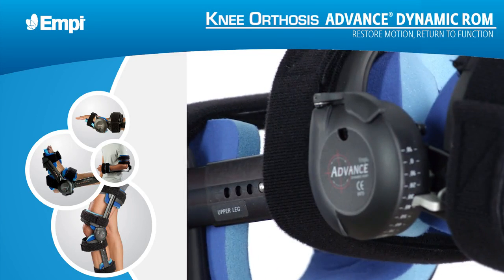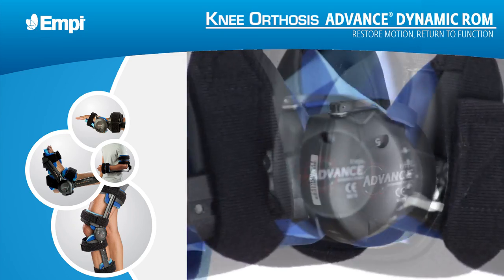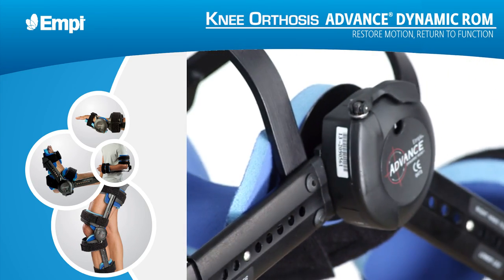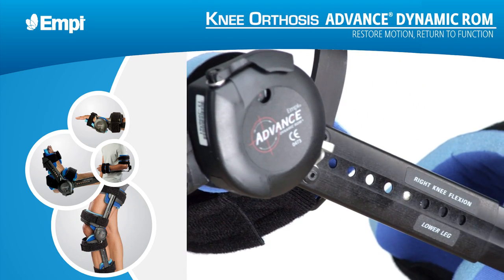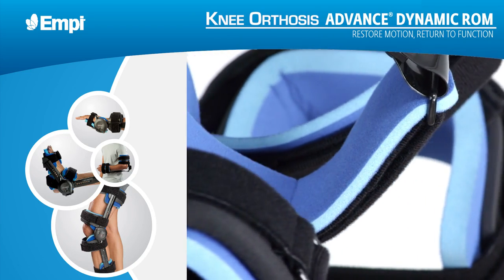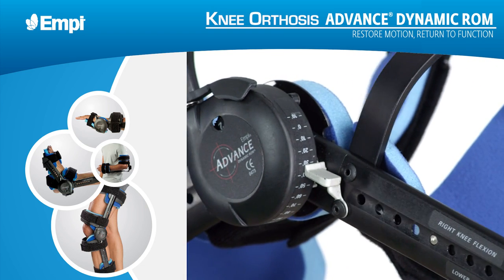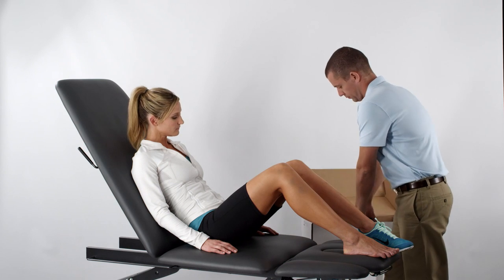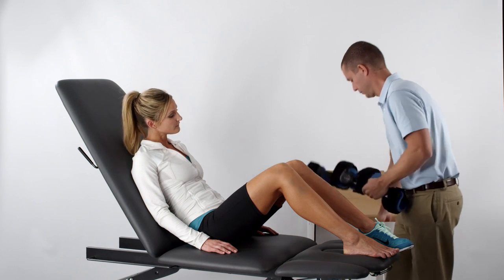The Empi Advanced Dynamic ROM Knee Orthosis, part of the Empi family of dynamic splinting devices, applies a low-load, progressive stretch to the knee to help increase a patient's range of motion. The instructions in this video are designed to help ensure that patients receive the maximum possible benefit from their range of motion therapy. After you remove the device from its carton, check the labels on the inside strut to make sure you have the correct unit.